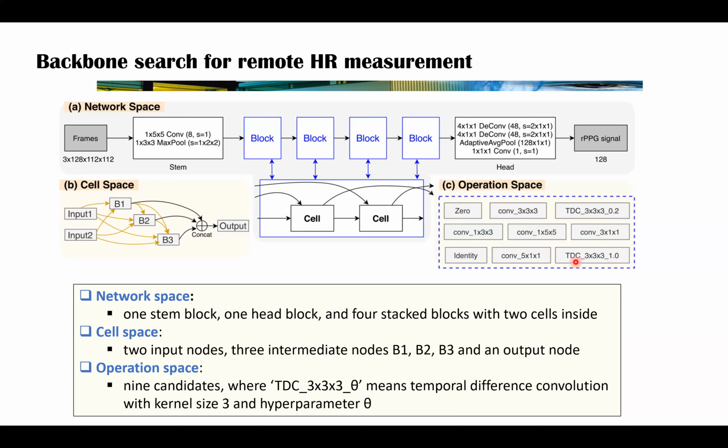So we assume that with this huge search space, they can search more suitable architectures or operators for rPPG measurement.